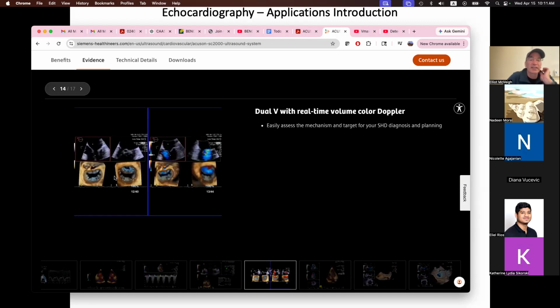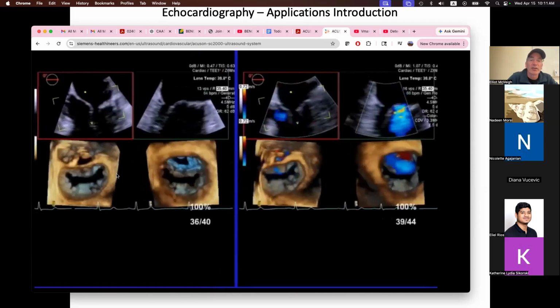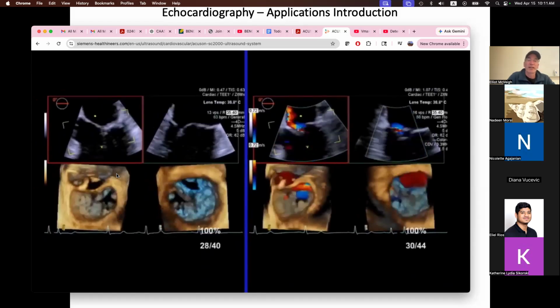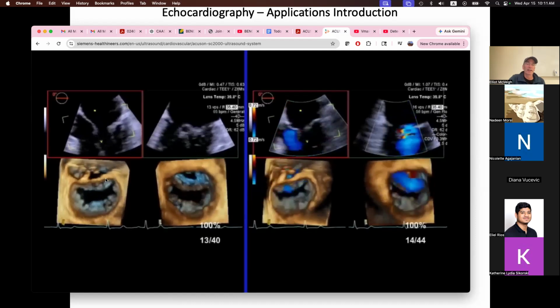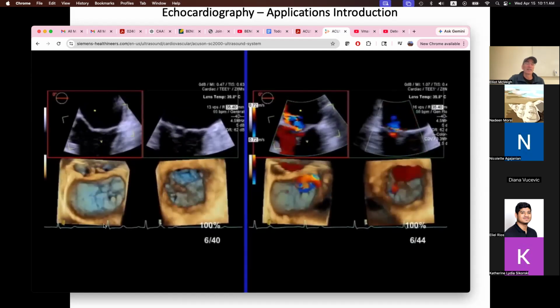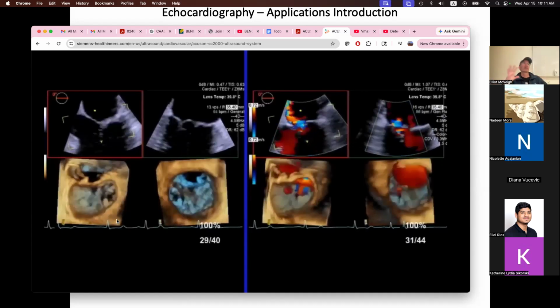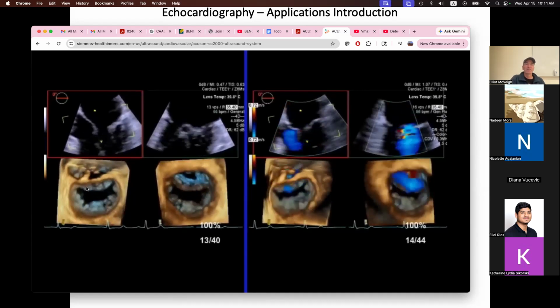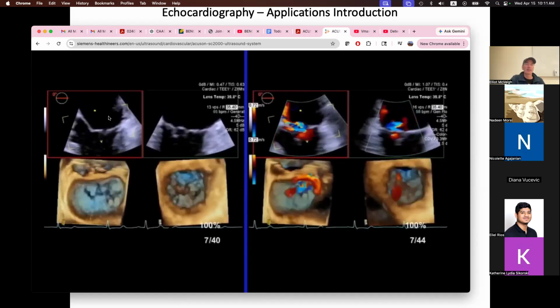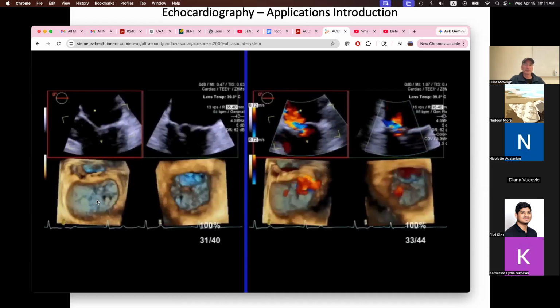Again, this is something that's fairly new. I mean, it's been around for maybe 5 years, but that's a 3D or a 4D, right? This is a 4D image in that it's 3 dimensions, 3D voxels over time. So it's like 4D CT. This is what a slice through it looks like, looking at this valve shutting.